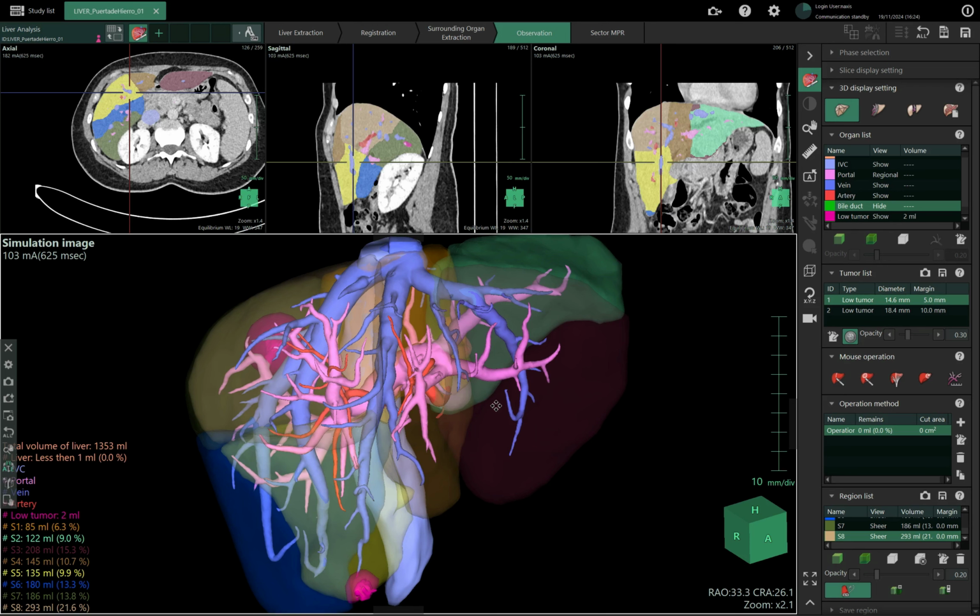And to extract this, they have to spend at least 1 hour. There are two really skilled radiographers who are very accustomed to extracting veins and vessels and modifying whatever. They do the extractions with our software in 5 minutes, maybe less. With any other software before they bought our solution, you spent like 1 hour per study. So they say that it really is good, really works great.